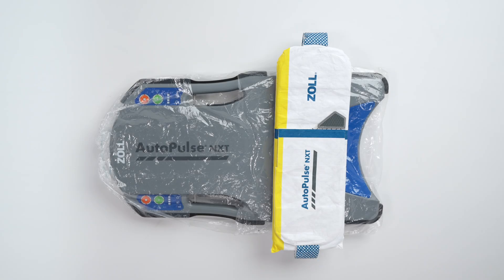The AutoPulse NXT Resuscitation System includes a hygiene barrier to help reduce contamination during use. If your facility uses the hygiene barrier, always install a new hygiene barrier before installing a new AutoPulse NXT band. Refer to the Hygiene Barrier module for installation instructions.